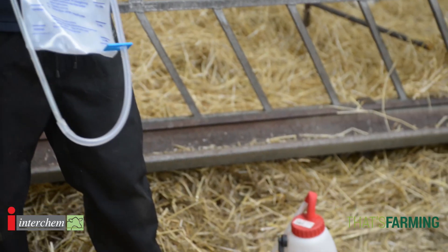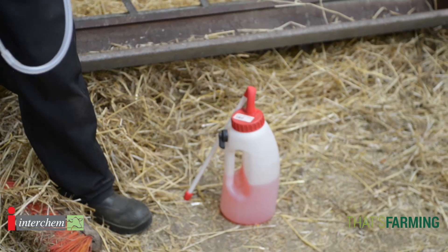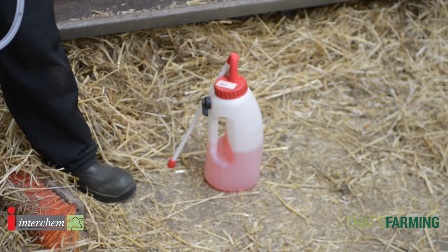One thing we'll say is maybe have two stomach tubes on your farm: one for colostrum and one for treating the sick calf or rehydrating the calf.